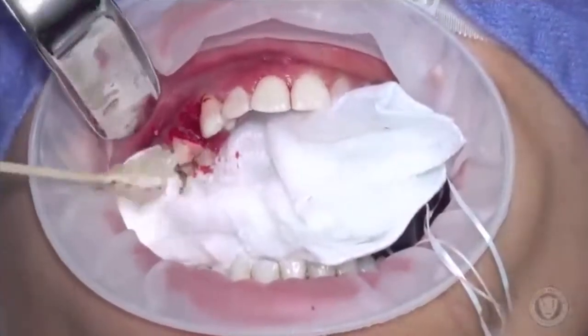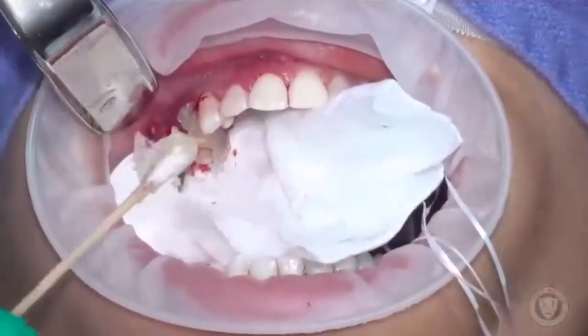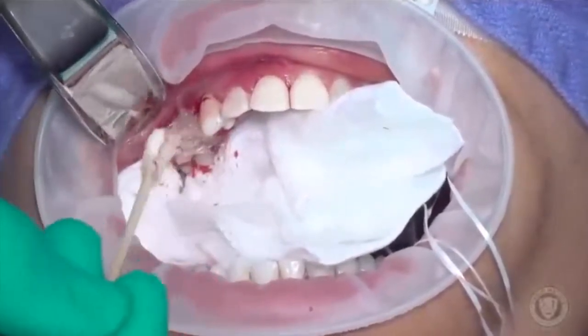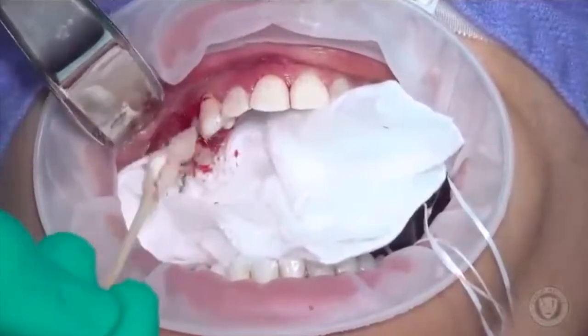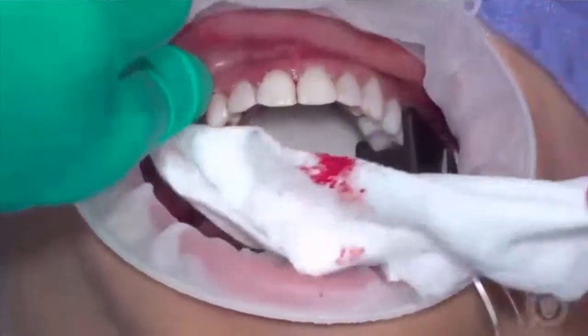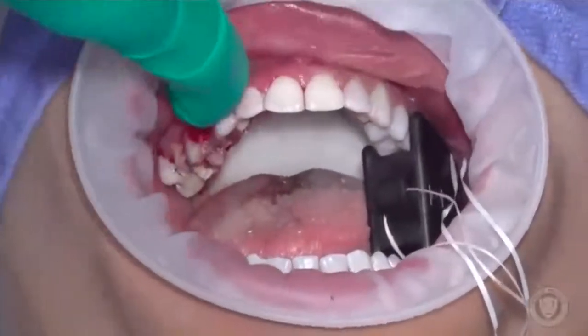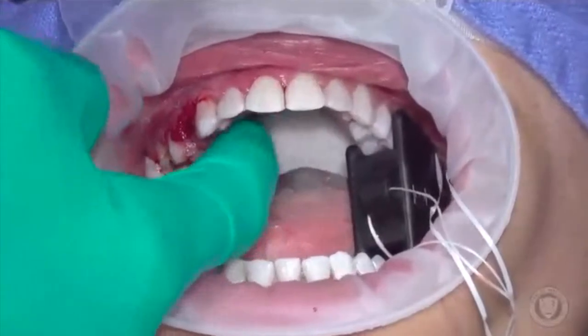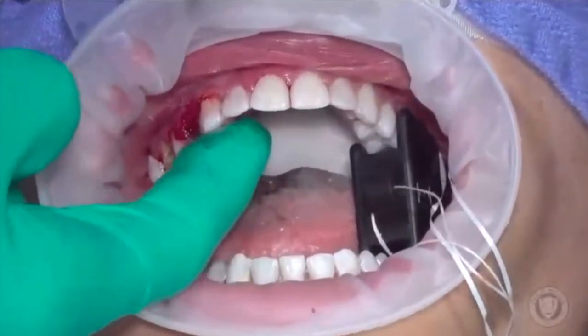Now the Vaseline comes in and we start by just rubbing it in with a cotton swab — it helps us get into locations we need to reach. Then I like to use the finger, coming in on the buccal and making sure we don't have any issues with the tongue or lip getting stuck to the extraction site.